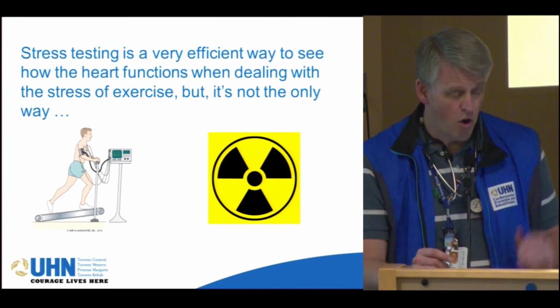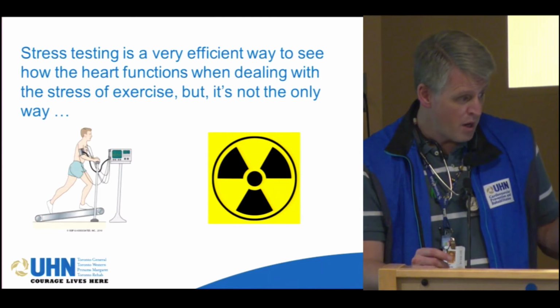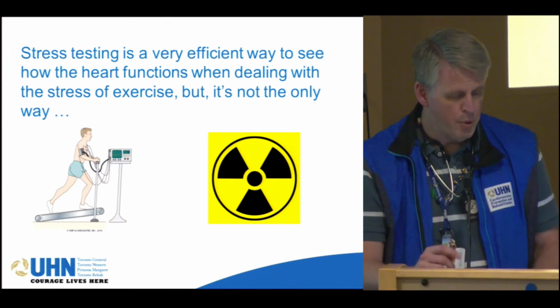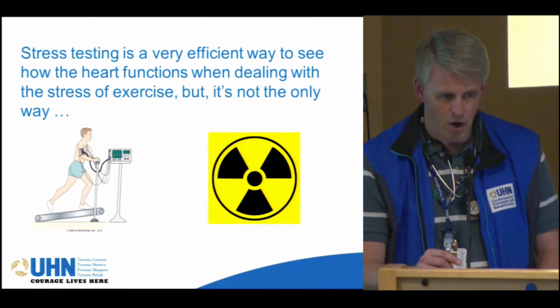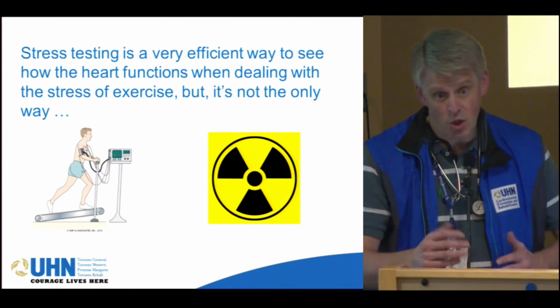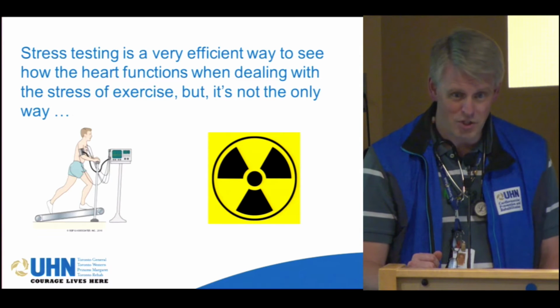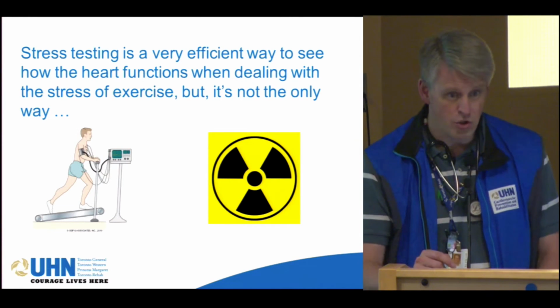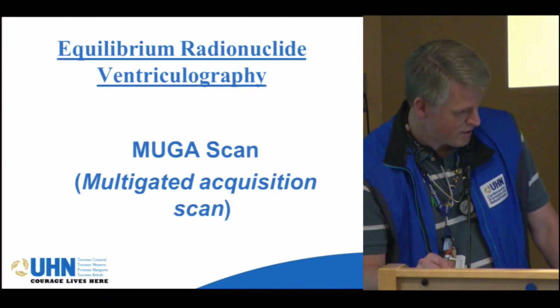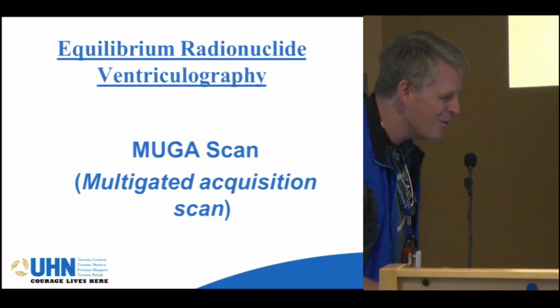So stress testing is great, and all the procedures or investigations that we've looked at so far are fairly low risk, nice and easy, and they work really well. But there are multiple ways to look at different problems. We talked a little bit with Marissa about stress testing to see how the heart moves. That's not the only way to see how the heart muscle itself is working. You can do, as I've got this lovely nuclear image up here, a bunch of different nuclear type procedures, which also give your cardiologist a lot of information. So with that thought in mind, we are going to listen to Cindy, right? Cindy, come on up and she'll talk to us about nuclear options.